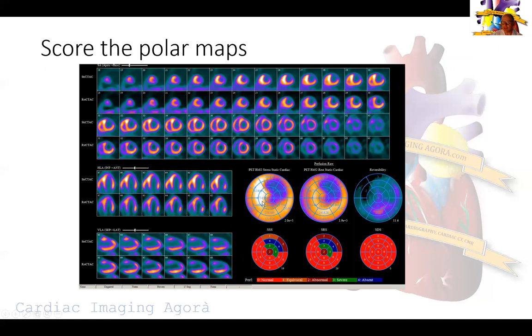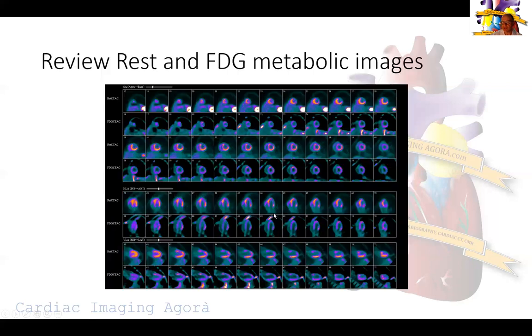Now we score this defect. I tried to superimpose the raw counts from PET, which is sometimes helpful when you have scaling artifacts. The raw counts show a very clear fixed perfusion defect inferolaterally, sparing the basal inferior wall and the apex. The septum is fine. Despite the software reading a reversible defect in the inferior wall, visually there's not much reversibility — by counts they're in the same range, and if anything the inferior wall has higher counts. Sometimes the software is a bit too sensitive and you have to adjust for it.